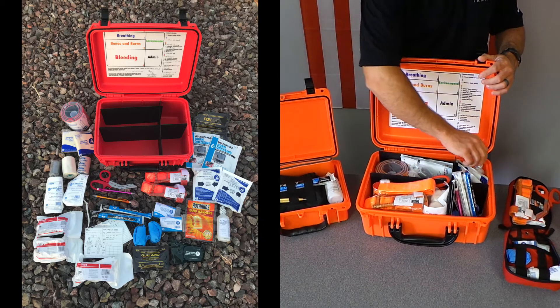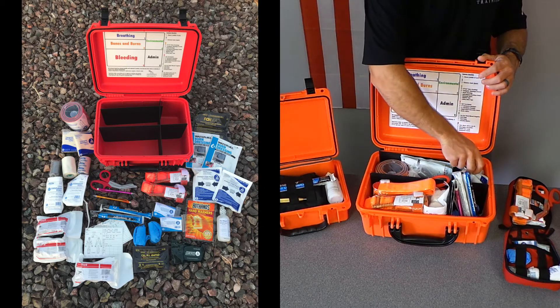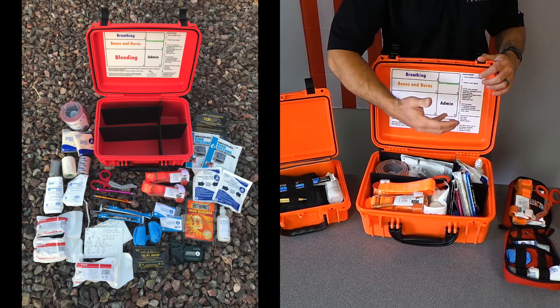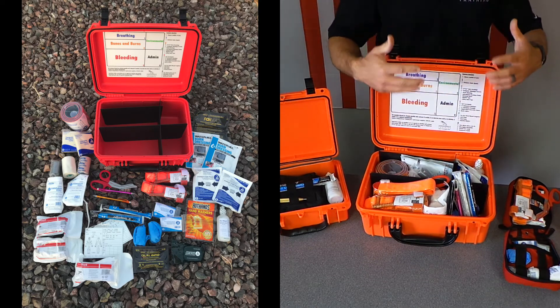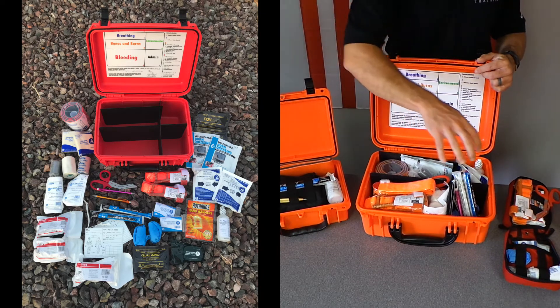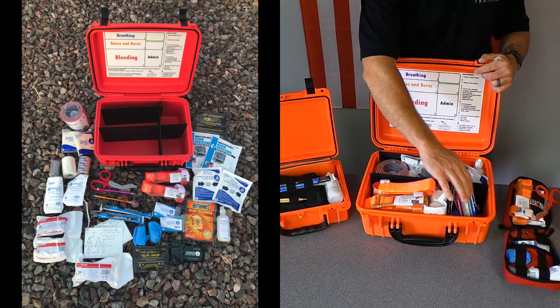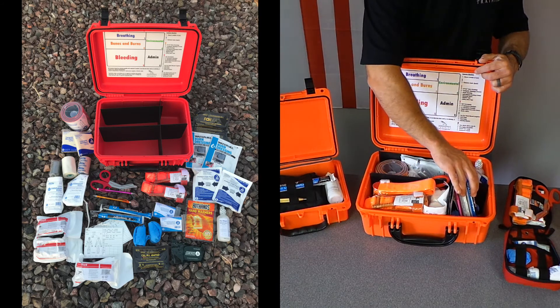In our environmental section, we have eye wash for wound irrigation, cold packs and hot packs for environmental concerns to include shock, and a couple of emergency blankets for treatment of shock and other environmental concerns as well. And then lastly, in our administrative section, we have gloves, patient care cards, writing implements for taking notes, and hands-free lights.